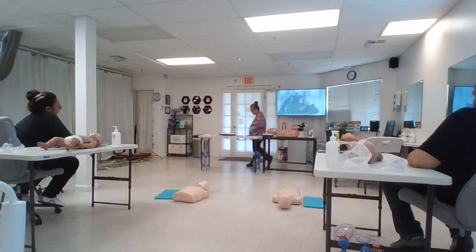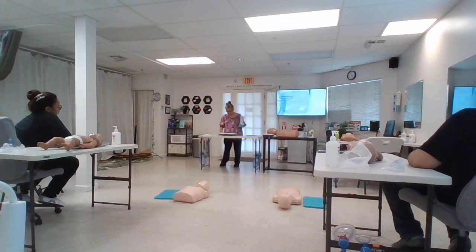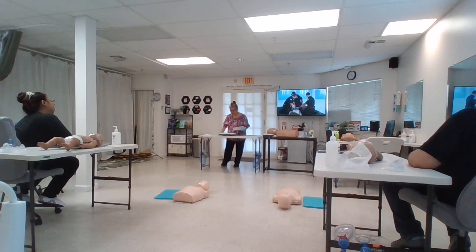As a BLS provider, you may notice that advanced providers check for a pulse, pre-charge the defibrillator, and prepare to deliver a shock about 15 seconds before pausing compressions at the end of each 2-minute cycle. When using an AED, the prompts will instruct you when to pause. For example, during rhythm analysis or shock delivery.